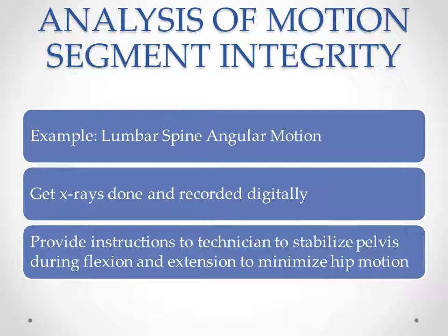And nothing is less persuasive than low-quality, non-diagnostic X-ray images.